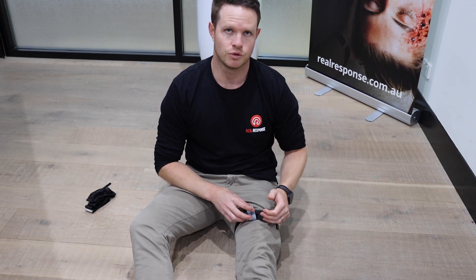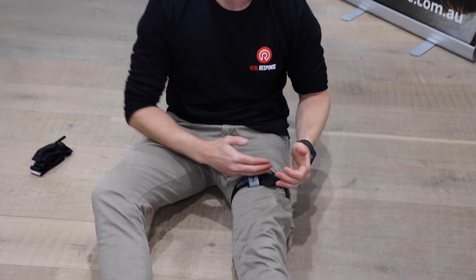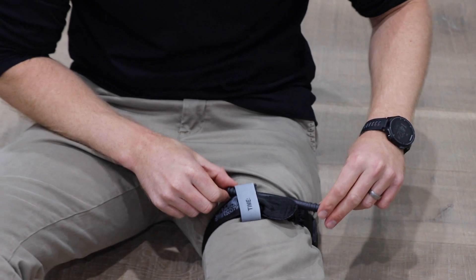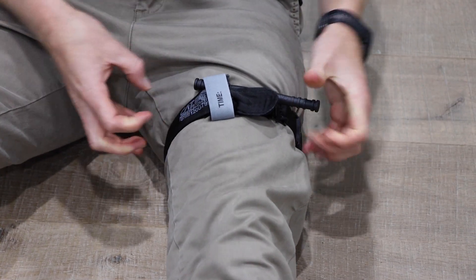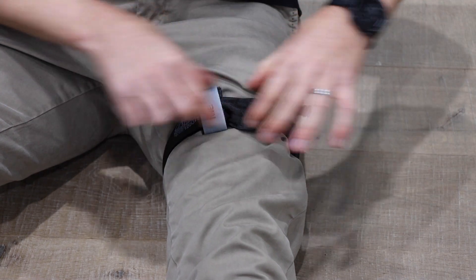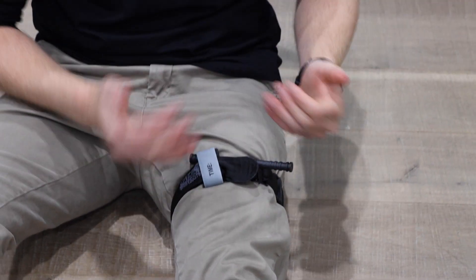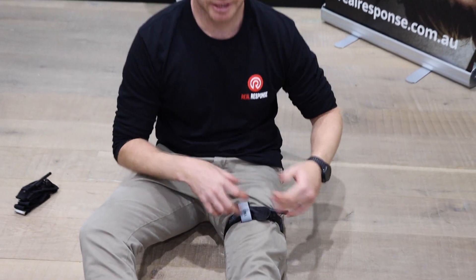A good thing to remember: your tourniquet should be parallel and your windlass facing uppermost - not getting caught in the groin or underneath the leg making it difficult to twist. Also ensure the tourniquet is parallel. If it's a little bit skewed, you risk that tourniquet loosening and sliding down the leg, causing your patient to bleed out.